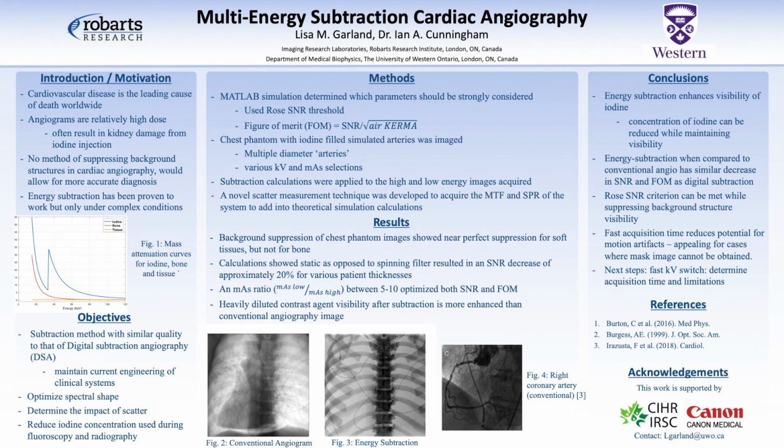Moving on to methods, I think it's important to start with an understanding of multi-energy imaging. So looking at figure 1, we can see that the blue curve, which is iodine's attenuation coefficient as a function of energy, has a K-edge around 33 keV.